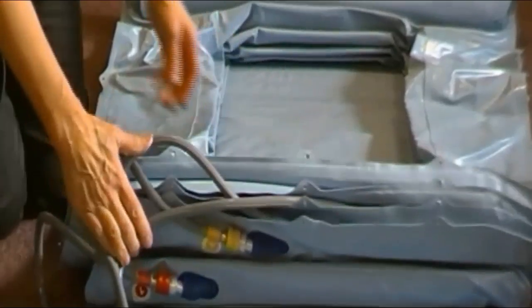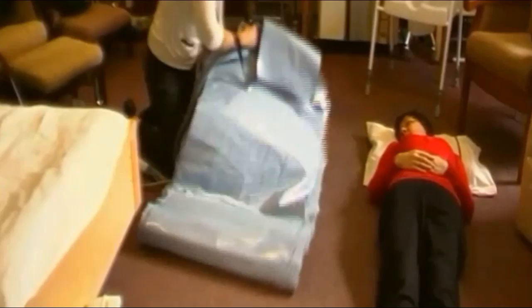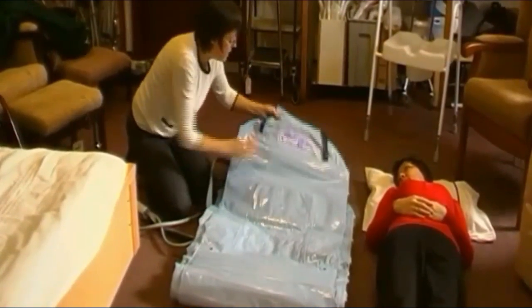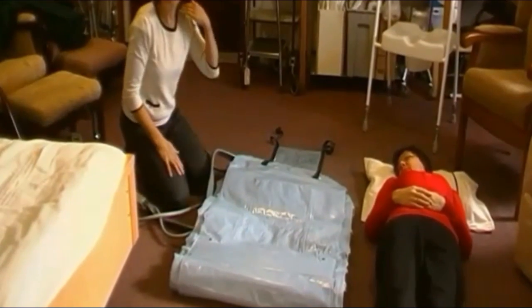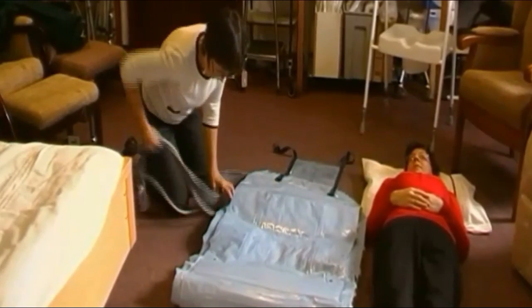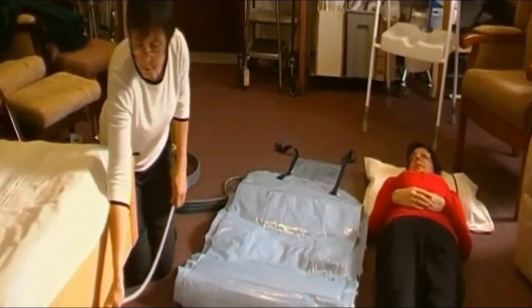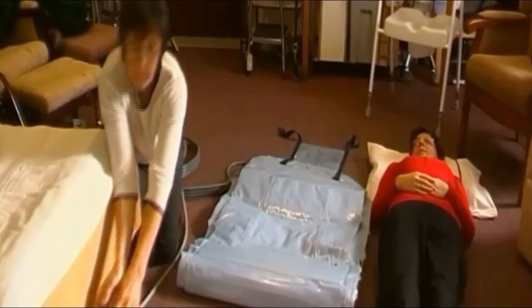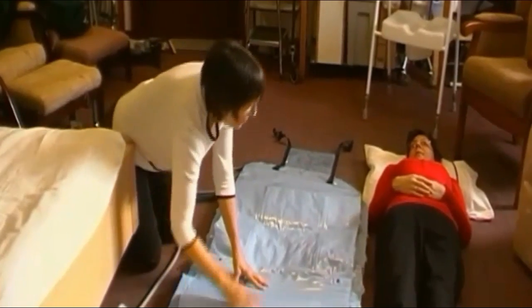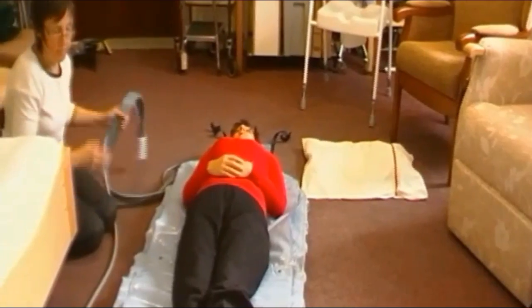Now once we get to this stage, we need to flip the whole thing over. The purple piece here, where it says camel, is where your client's neck wants to lie, to be in the right position when they're being lifted. So we then want to plug this into the compressor. It's ready for use. And we can use a glide sheet to assist Christine onto the cushion.